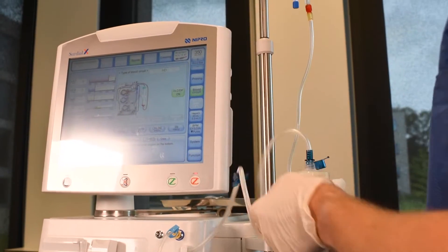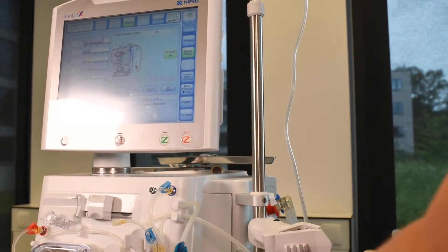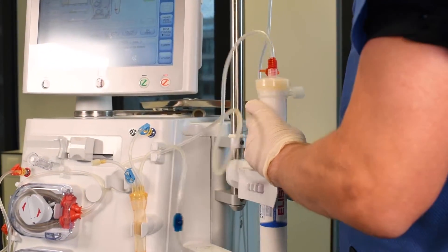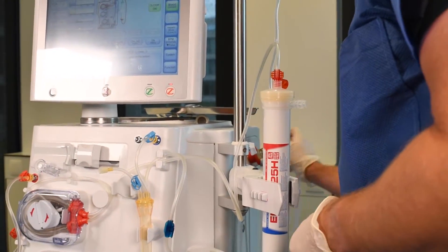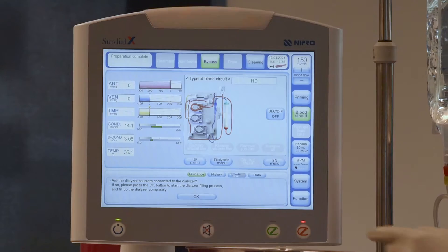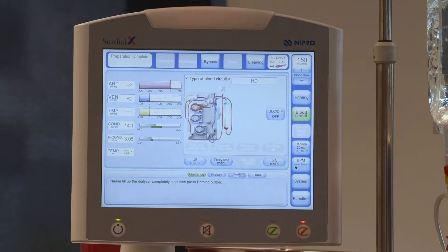Before priming the dialyser compartment, turn the dialyser with the blue side down as prompted by the machine and attach the dialyser couplers. Once the couplers have been attached, follow the screen prompt and press OK to fill the dialysate compartment.